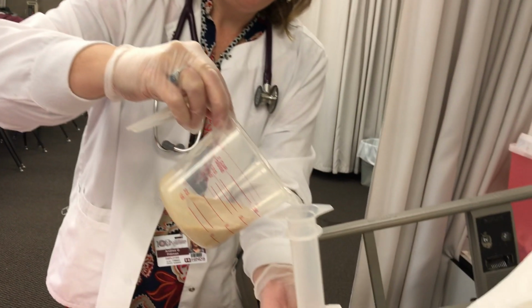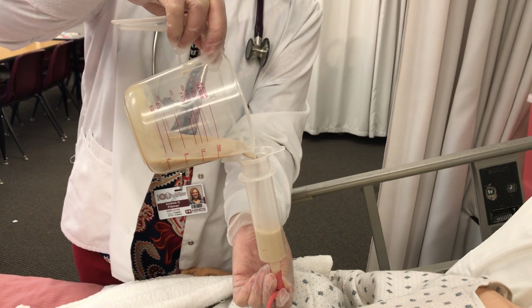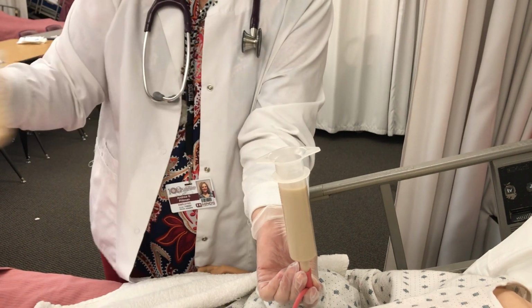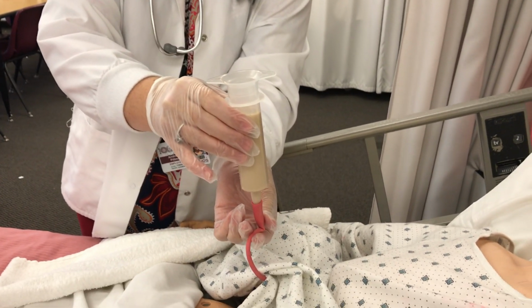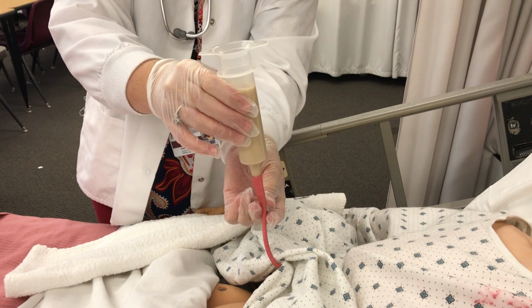Now we will slowly pour this, and we're giving this a bolus to gravity because our feeding is not on a pump. And so we may not be able to, depending on the size of our syringe, we'll just let this go in slowly, and we'll catch it before.